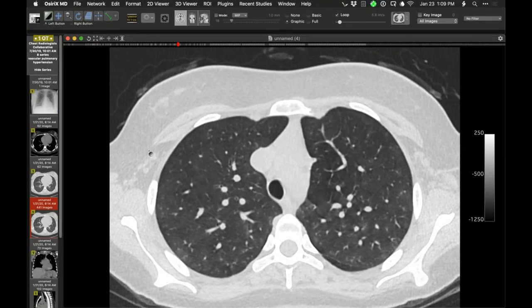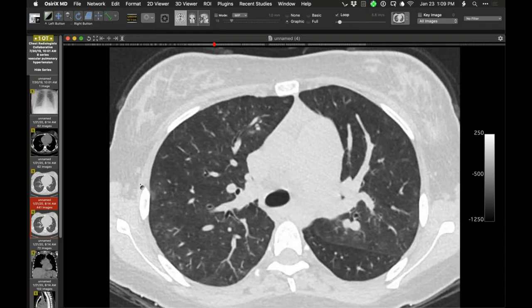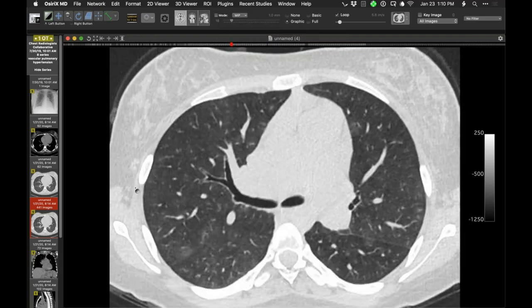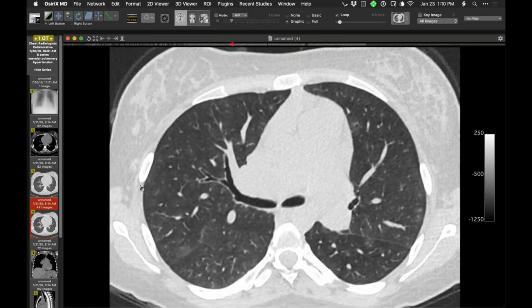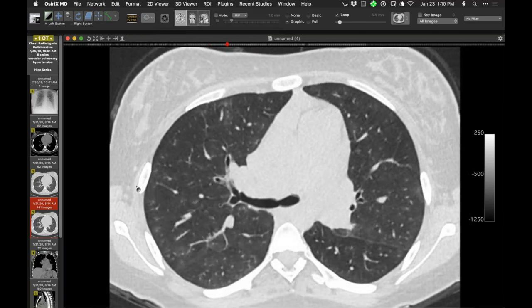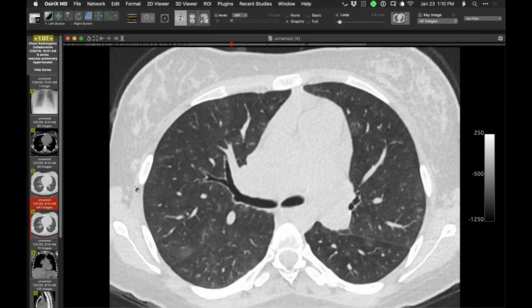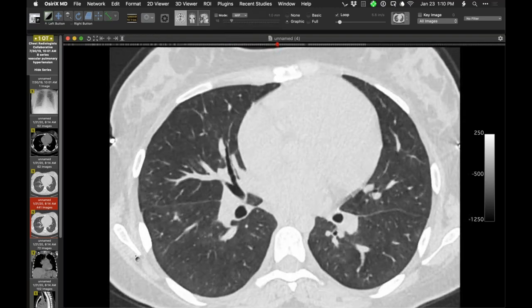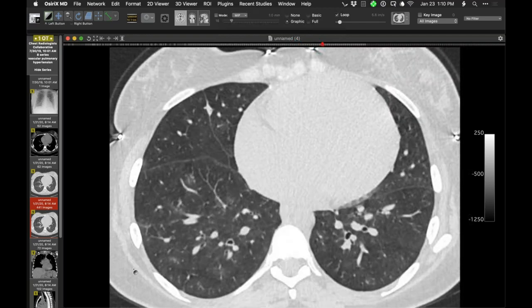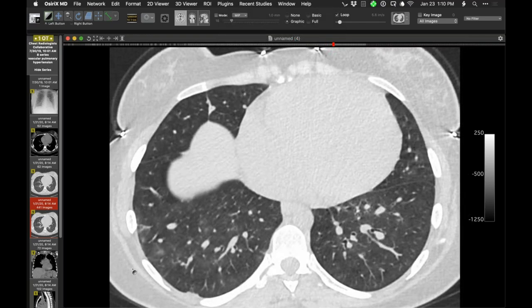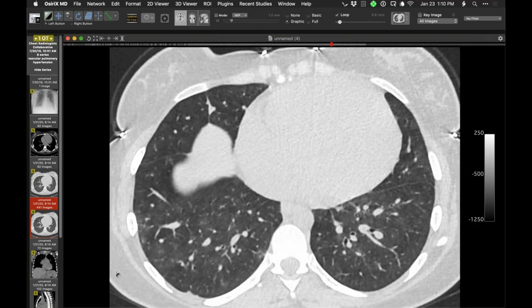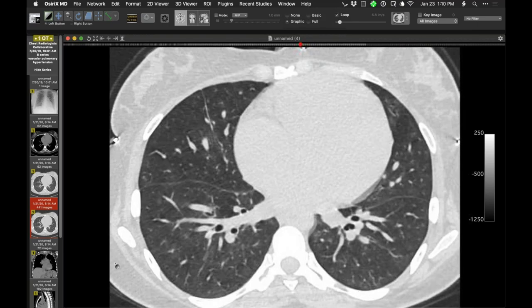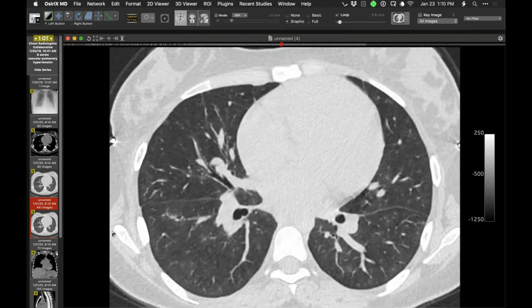We've shown cases like this before, but this is a particularly dramatic example of some of the pulmonary findings one may see with any cause of severe longstanding pulmonary hypertension. What's really conspicuous is the mosaic attenuation pattern. But in addition to that, there are multiple foci of ground glass attenuation — subsegmental size, patchy ground glass attenuation in the lungs, all over. It's obviously heterogeneous.